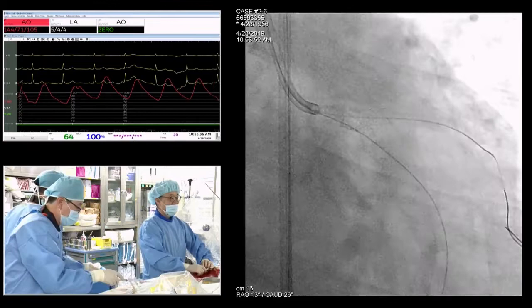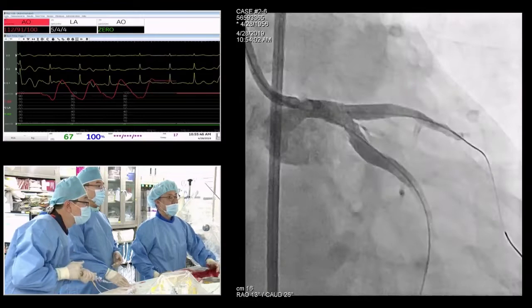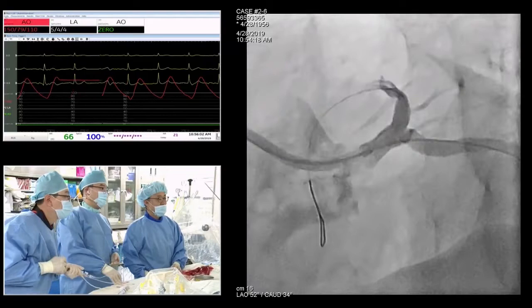Okay, we're going to check the angio. Without the IVUS, the stent looks well deployed on the angiogram. The overlapped stent has moved down toward the ostium of the circ, which is a better sign. Okay, great. So we're going to check the IVUS.